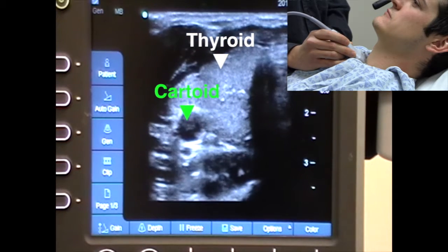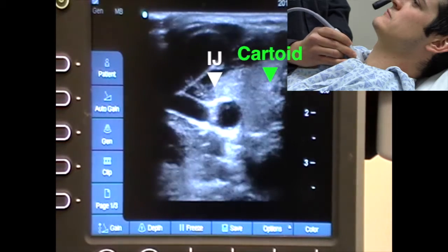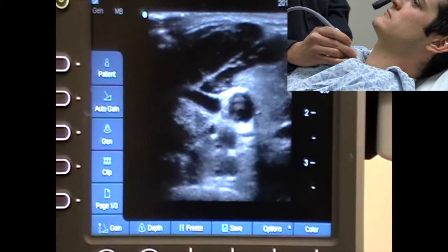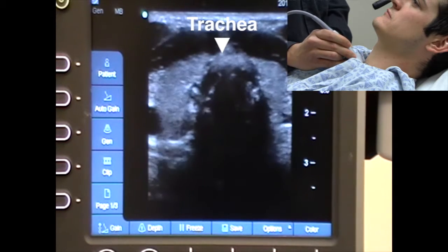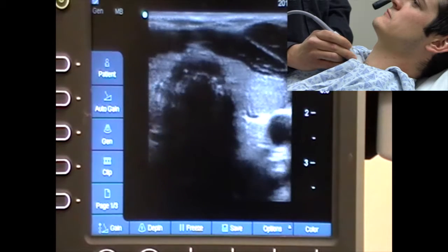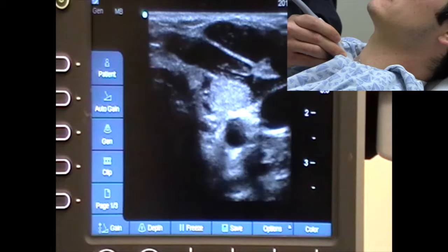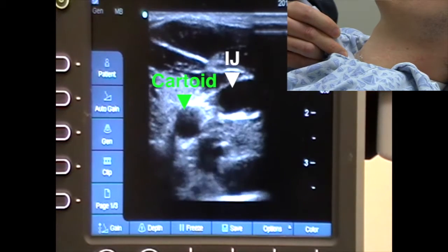The trachea looks like a circle because that's the shape of the trachea. If you go lateral, you'll see the right part of the thyroid as well as the right carotid artery, and if you go even more lateral, you'll see the internal jugular vein and the carotid artery. If I come back to center, I'll see the trachea as well as some neck muscles anterior to the trachea. Going the other direction, I'll see the left portion of the thyroid, the left carotid artery, and the left internal jugular vein.